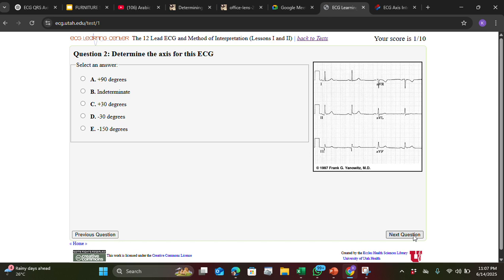So usually, it is numbers that are greater than 180 that need this. Because if it's less than 180, it's always on the graph. This one is just for the ones that are not on the graph. Please don't go and be doing it, because 30 is less than 180. Don't go and be adding this. So that's minus 150.